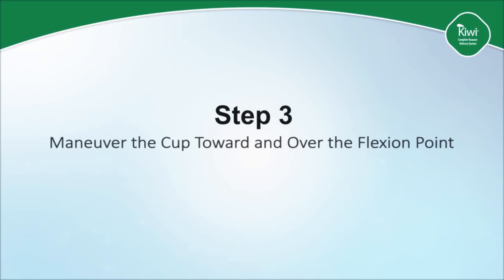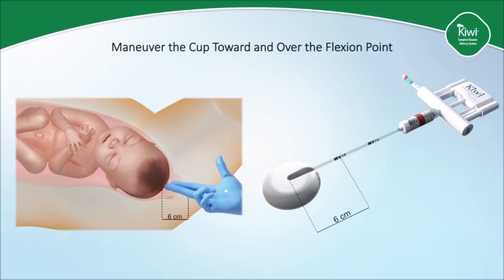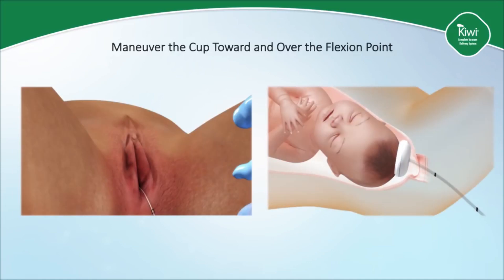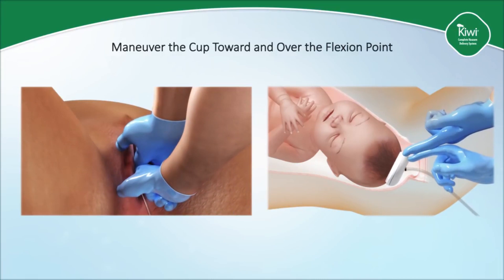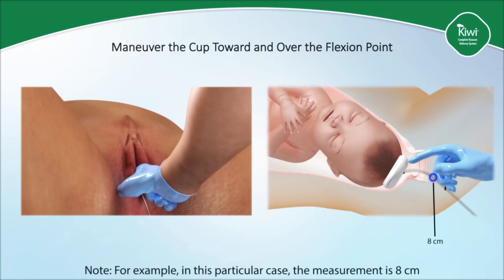Step three is to maneuver the cup toward and over the flexion point. Note the Kiwi Omnicup contains marks at 6 and 11 centimeters to assist the user with accurate insertion distance to place the cup over the flexion point. Once the cup is placed against the fetal head, the clinician should note where the stem of the Kiwi Omnicup intersects the posterior fourchette. If the distance is not what was measured in step one, then use both index fingers to push the cup posteriorly in the midline of the maternal pelvis until the mark of the stem is equal to the distance calculated in step one, which was 8 centimeters in this example.